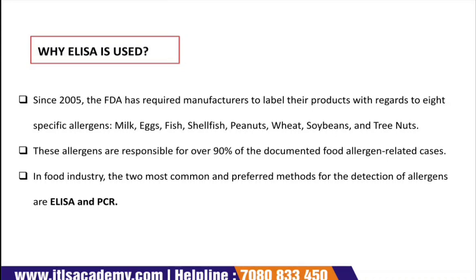Their high sensitivity and high specificity make them an indispensable tool for complying with regulatory standards and preventing food safety incidents. There are industries that claim their products are allergen free, and for these claims, ELISA, the sandwich ELISA, provides a highly sensitive and specific means to verify them, so they are really ensuring that they meet safety standards and protect consumers from food allergens.